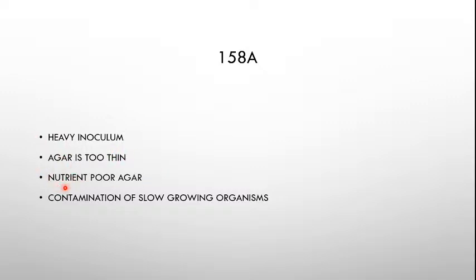Agar is too thin. Nutrient poor agar. Paano tayo magkakaroon ng nutrient poor agar? Yung mga expired na culture media. Kaya hindi tayo gumagamit ng expired sa micro. Okay? Okay ba yon? Mark ha? Pag nagpatayo ka ng laboratory, huwag kang gagamit ng expired. Alam ko marami nagbebenta dyan sa Bangbang. Alam ko yan. Gamit namin yan sa research namin dati eh. Okay? Contamination of slow-growing microorganisms.